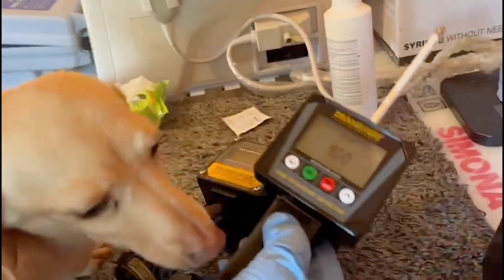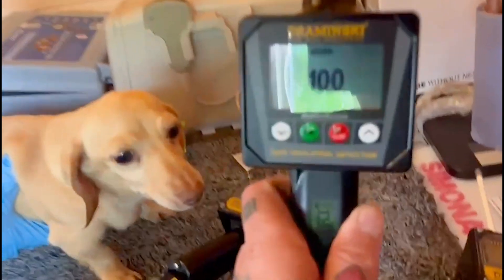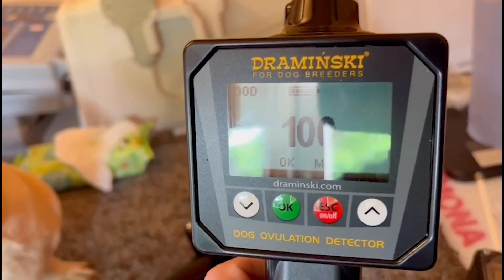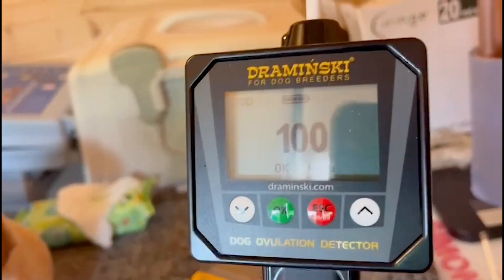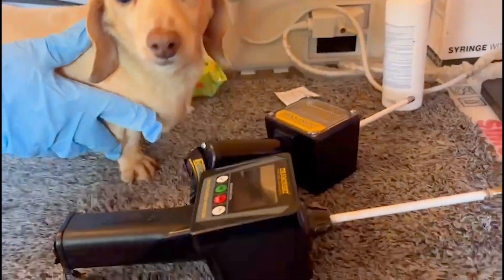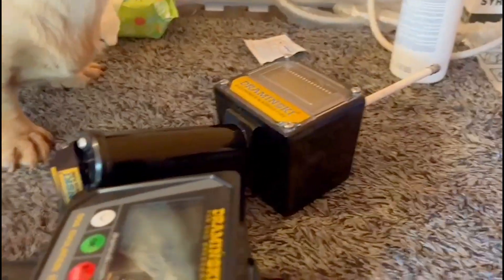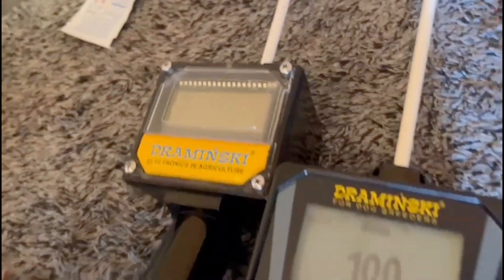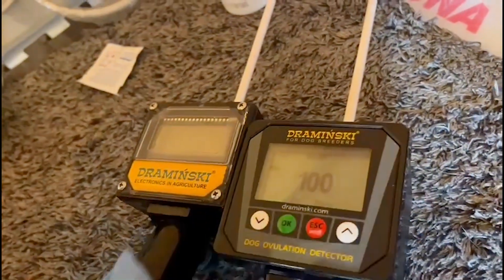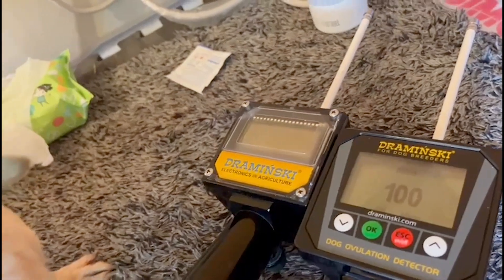Thanks to the Draminsky Ovulation Detector, we have stud clients who have been coming to us for years. They know the stud services they get here are good, and with Draminsky it works. When the season starts, the numbers will show around 200, then they go up every day or every other day.